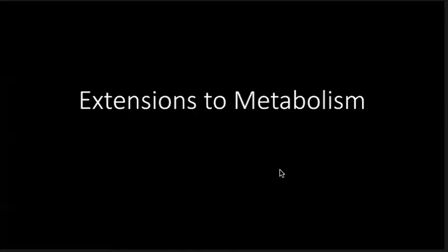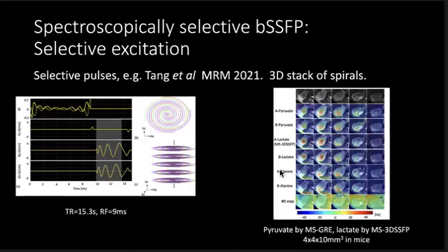And now, in the last few minutes, I've got about 5 minutes left, I want to talk about how we've been trying to push these balanced SSFP methods into carbon-13. And this stuff goes back a long way. I was looking at ways to do this with pyruvate years and years ago, and got distracted by other things, but I just wanted to put a few pulse sequences out there.